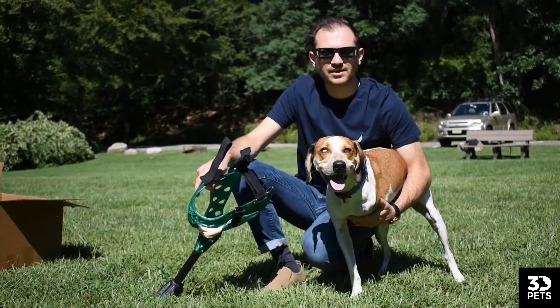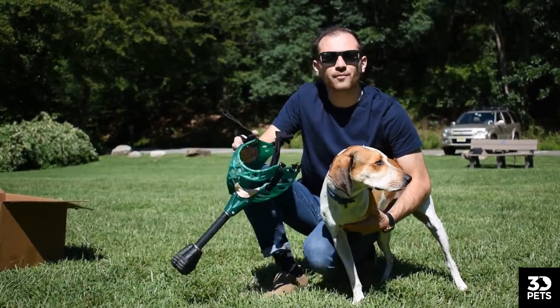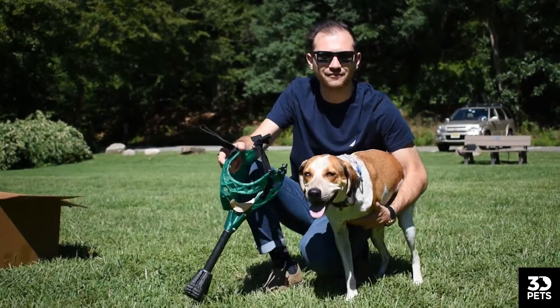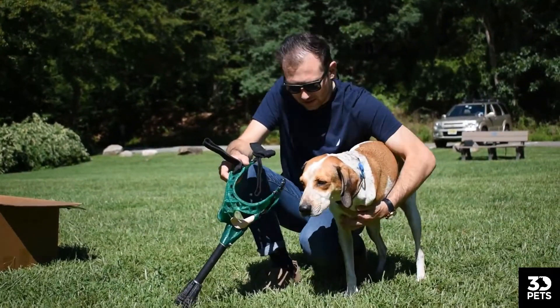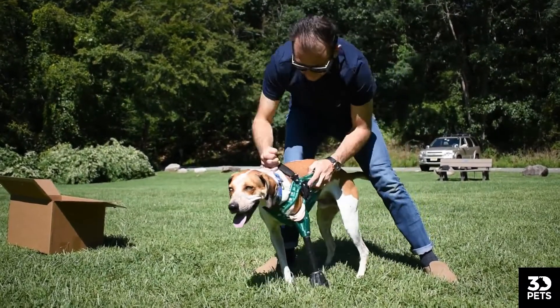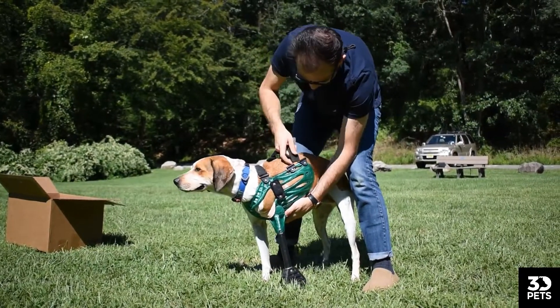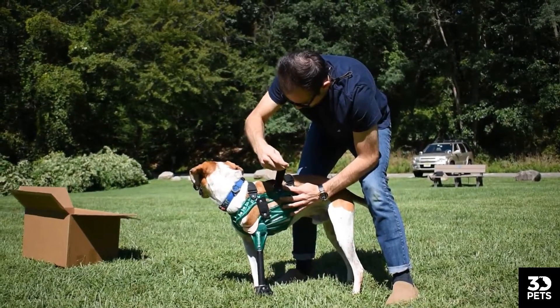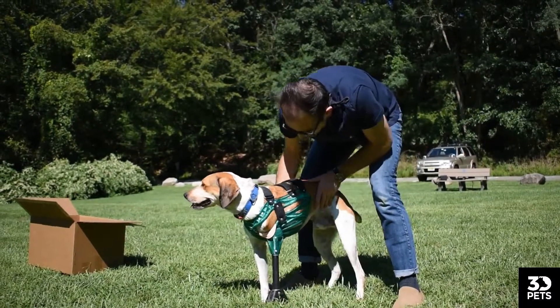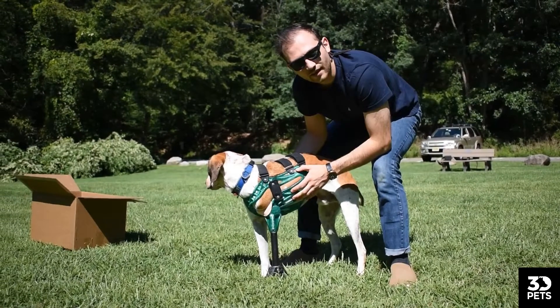I wrangled Jack from running in the field and now we're going to get the prosthetic with the leg attached on it. Mind you, Jack has been wearing this — your dog is going to act differently and that's okay. Everyone is a little bit different. We're going to run our strap through, and remember, we want that middle strap to be a little bit tighter, the front and back to just be snug. We have a good fit on Jack here.